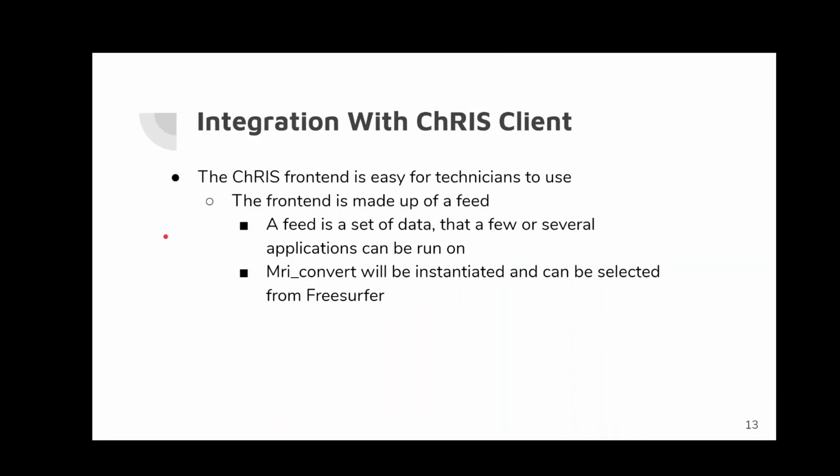In the near future, MRI Convert will be fully integrated within the CRIS client. The CRIS frontend is easy for technicians to use. This frontend is made up of a feed. A feed is a set of data that a few or several applications can be run on. MRI Convert will be instantiated and can be selected from its respective FreeSurfer application.